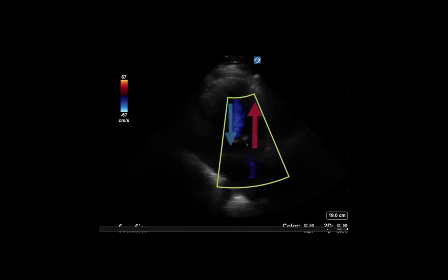And we actually see some aliasing here, and I expect some of you may have caught this already, where you see there's red flow, then blue flow, then red flow. Well, if you were to take that literally, that would mean that flow is going forwards, then backwards for a period of time, and then forwards again. When in actuality, this flow here that turns blue is simply too fast for the pulse wave Doppler physics to resolve, and so it assigns an incorrect value of it moving away from the transducer rather than towards the transducer. So this is no different than the sports car wheels spinning in the opposite direction.